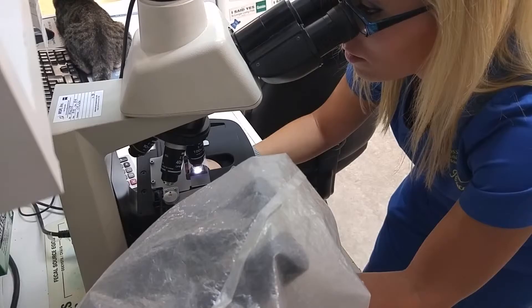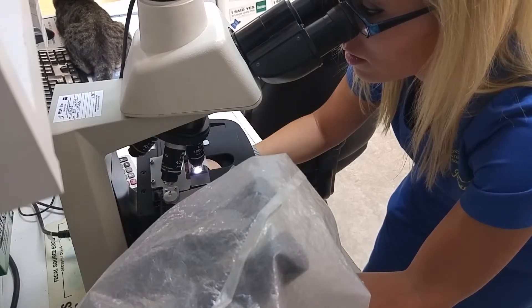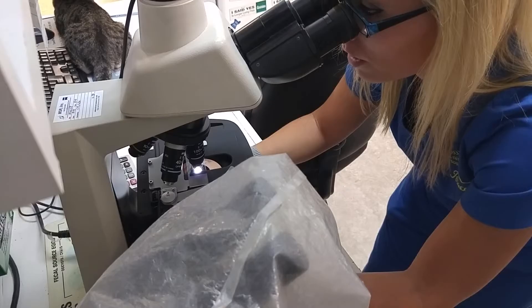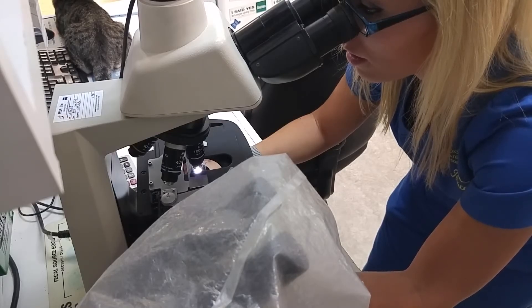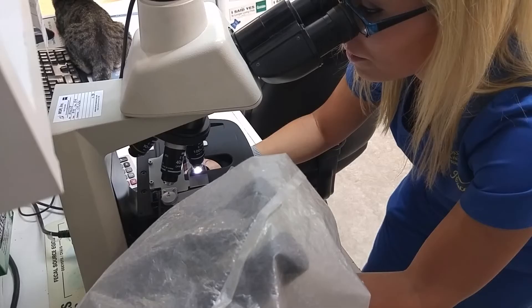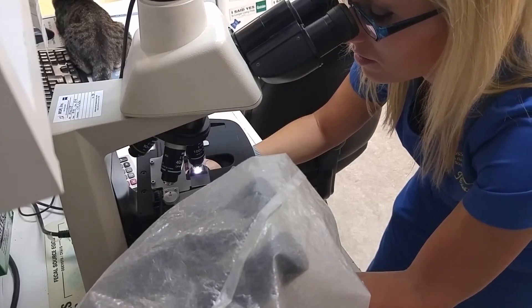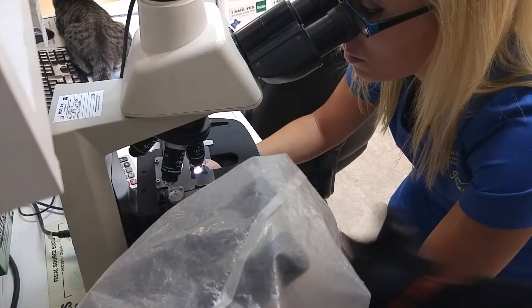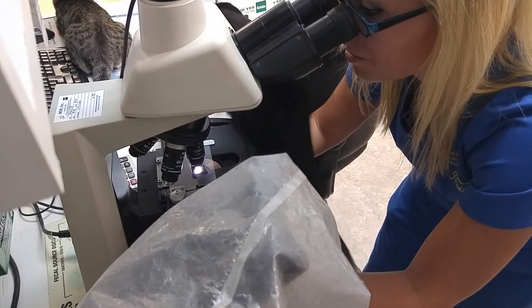Now what I'm looking for is any bacteria or any yeast. Bacteria being either cocci or rods. Right now I'm not really seeing either. We suspect that this kitty might have a food allergy. It doesn't have a whole lot of discharge under the ears but he's just scratching at them. But I do see a little bit of cocci.